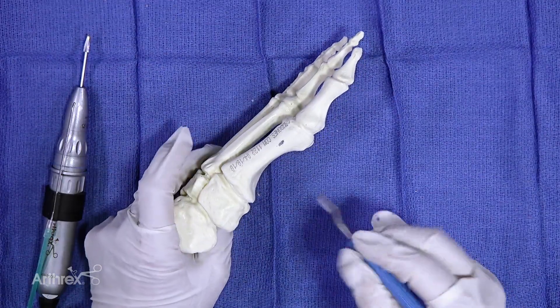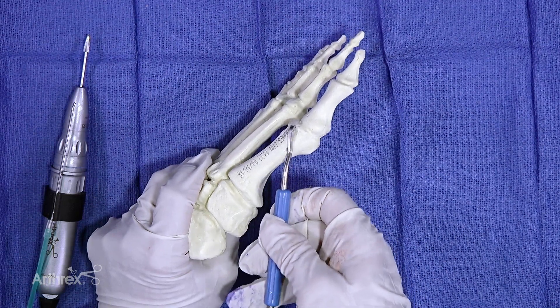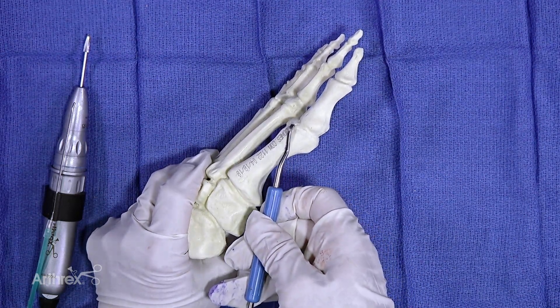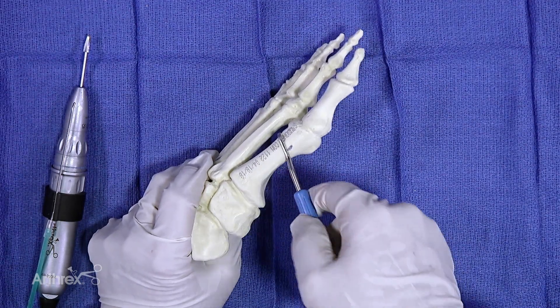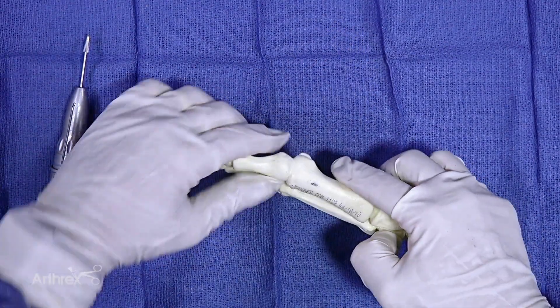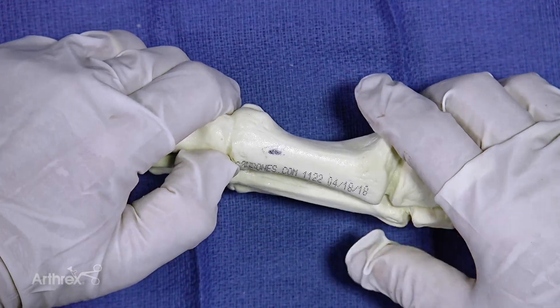The next step is to elevate the soft tissues up and around the bone. You don't really necessarily want to elevate past your osteophyte, but right to the osteophyte, and you can elevate all around the metatarsal head. Your contralateral hand is often beneficial to give you an idea of how far you're going to go with your chylectomy.